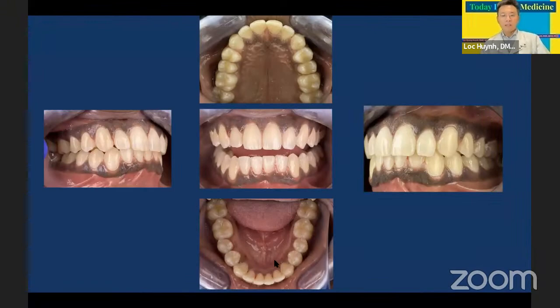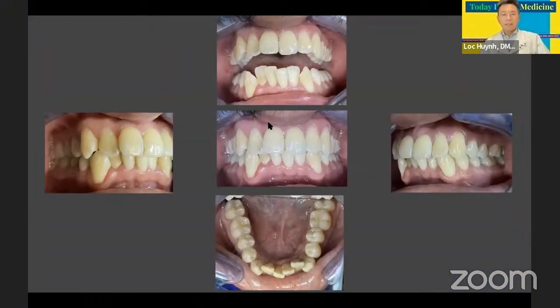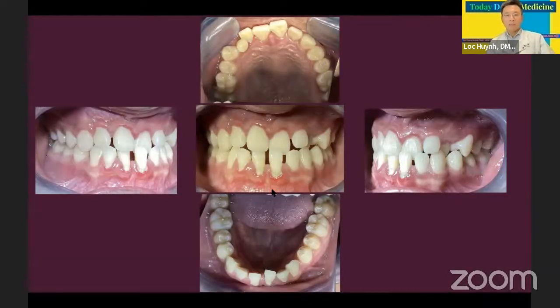This is decent retraction. And this is not so good. I want to show you this is not so good. The lip covers part of it, and the bottom too, not bad. I can see everything down here, but you want to have the lip pulled away so you can have more picture. As you just see here, this is a better quality photo.